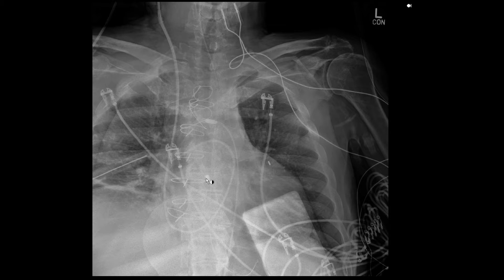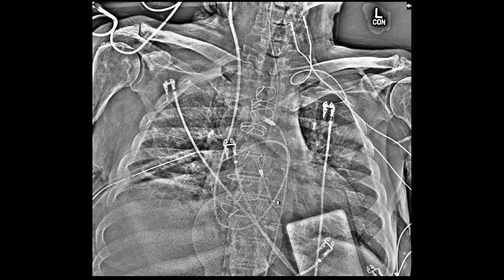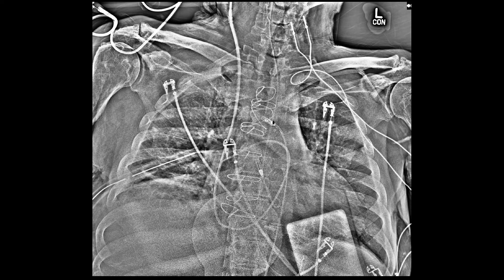In another example, the Impella is positioned too distally — too far into the aorta. The J-tip at the end should correspond to the LV apex, but here the device is mostly positioned in the proximal aorta. This is not optimal positioning of the LVAD device.